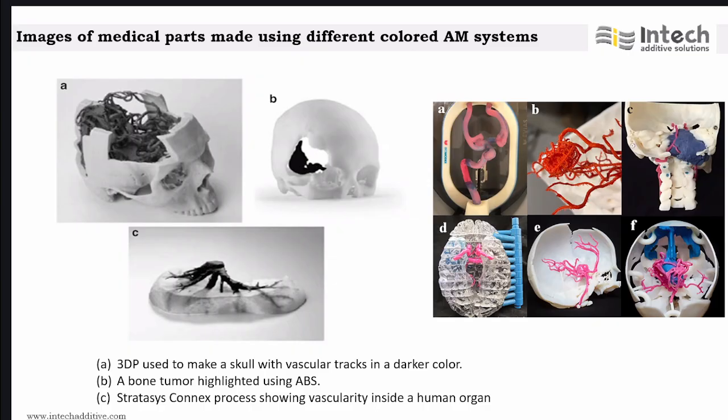And then brain section structures with color codings, where different regions have been differentiated. And then we have the brain cross sections with different color mappings showing the functional regions. And then we have the vascular structures. And also we have brains with blue arteries.